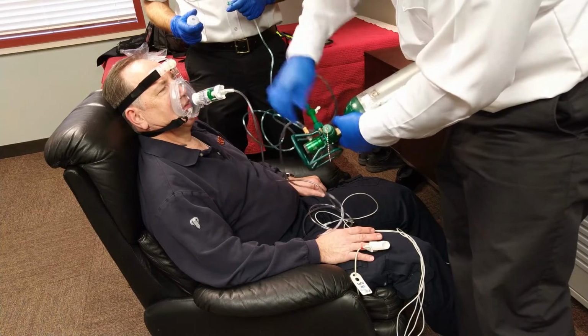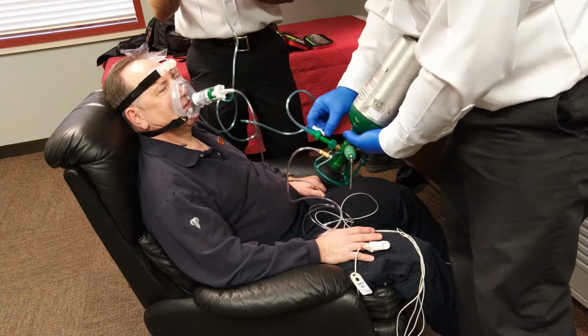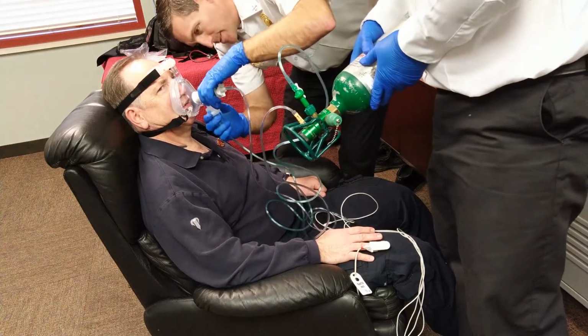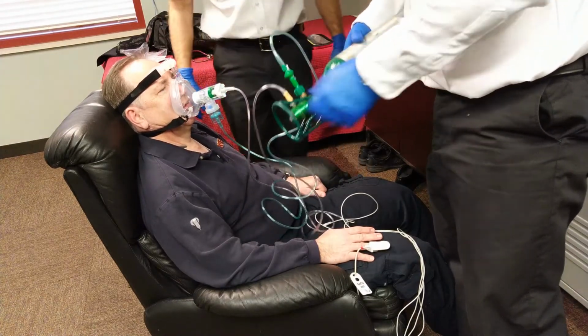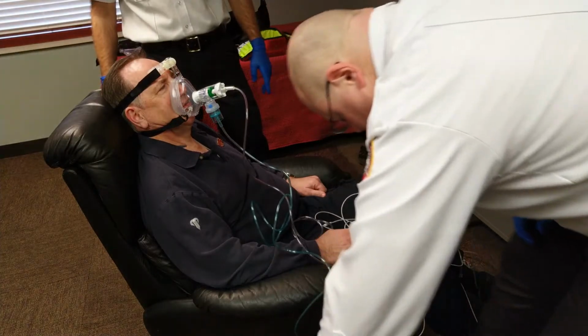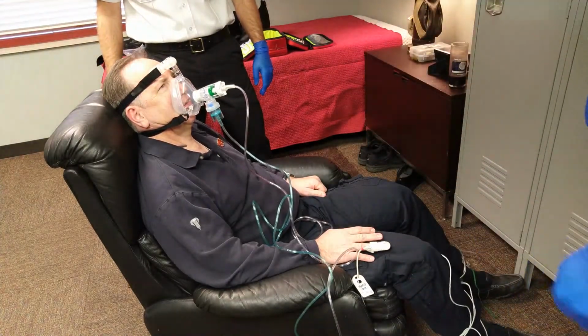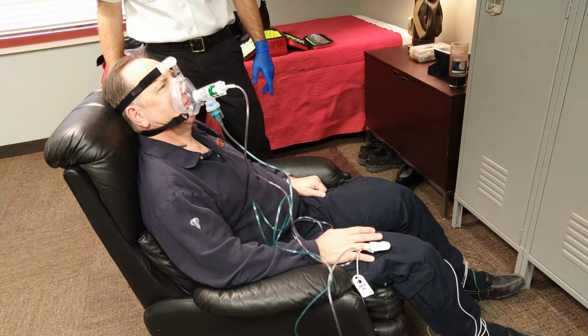It has a tendency to get cross-threaded, and then open the petcock, and that will automatically flow the correct rate to the nebulizer itself so you can run the CPAP device as well as a nebulizer off of a single bottle. Once you've done all that, reassess your patient, check for leaks, and you should be good for transport.